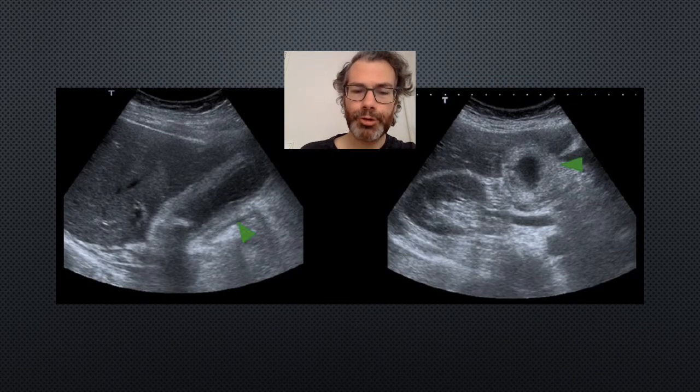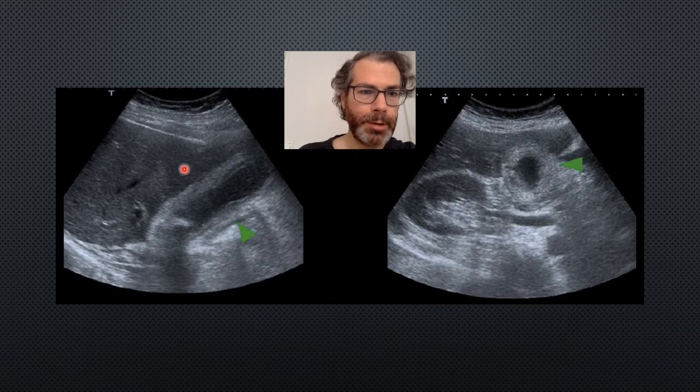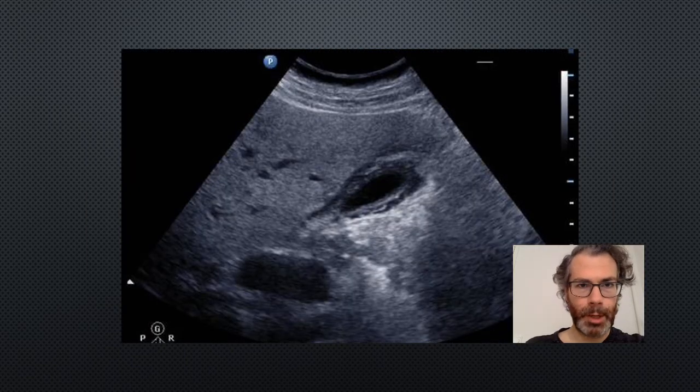And a lot of ultrasound is about pattern recognition, so I'll just show you a few more examples of acute cholecystitis now. Here's another beautiful picture with a gallstone in the neck and a grossly thickened wall and a little rim of pericholecystic fluid here. This is in long axis, and then this example is in short axis. Another very unhappy looking gallbladder here with a very thickened wall and some edema within the wall, the dark areas within the wall. A mucosal edema.